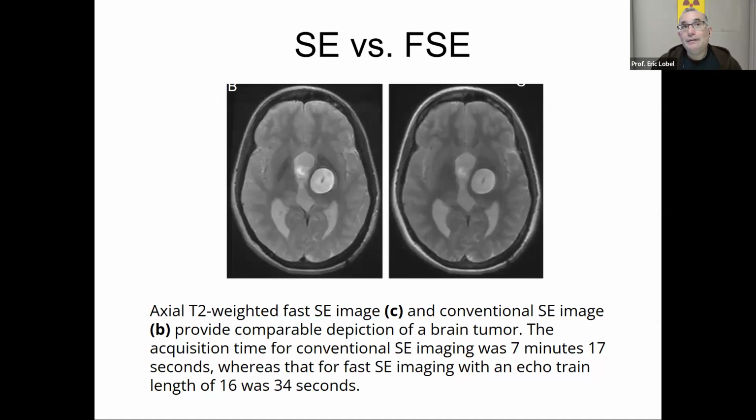So if you speed up one part of the sequence, but keep other parts the same, it's just one study that is going to be a little bit less time. So you save time and make more money, right? Kind of like shove more patients into the scanner. You used to have like 45 minutes between, now they're getting people in there in like 15 minutes. It's never going to be as fast as CAT scan, but it's getting faster.